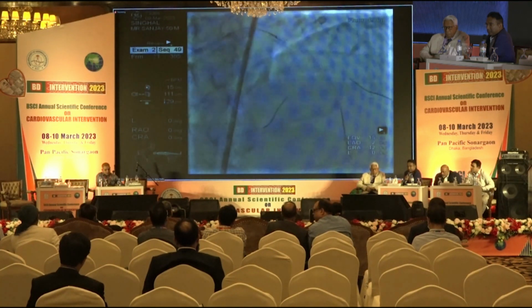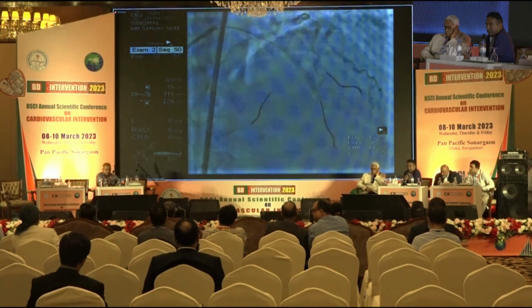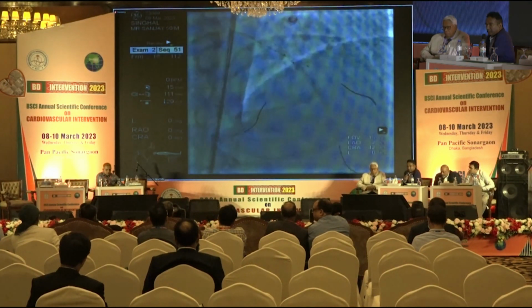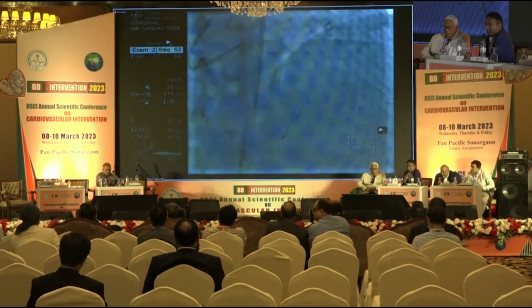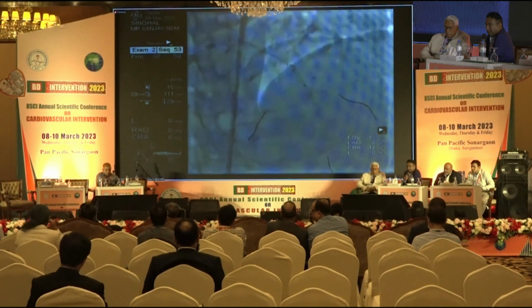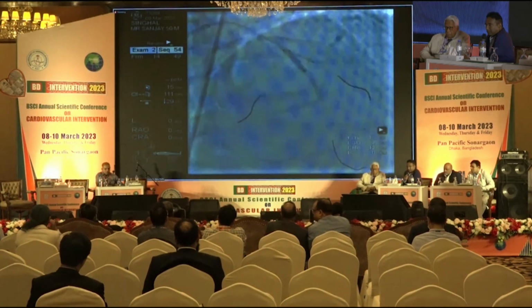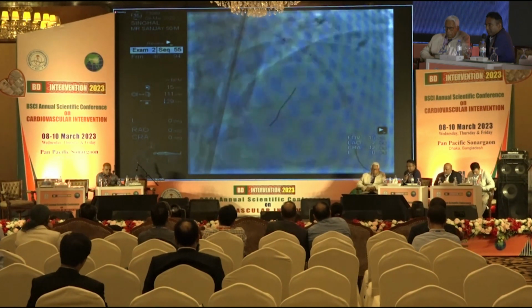Okay, sir. And we crossed into the diagonal and got it flowing, and then did a kissing balloon with a non-compliant 2 millimeter into the diagonal. Having done that, we opened the diagonal, and finally did a kissing balloon. We were quite happy having reperfused the diagonal. And so a distal job was done.